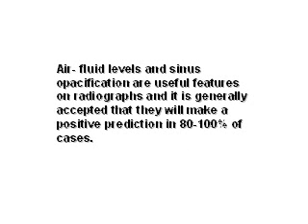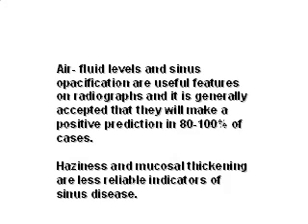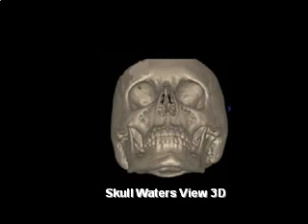Air fluid levels and sinus opacifications are useful features on radiographs, and it is generally accepted that they will make a positive prediction in 80 to 100% of the cases. Haziness and mucosal thickening, however, are less reliable indicators of sinus disease. This shows the skull in a Waters view in 3D.